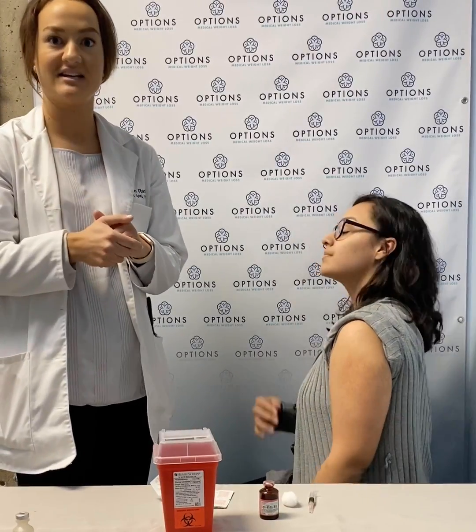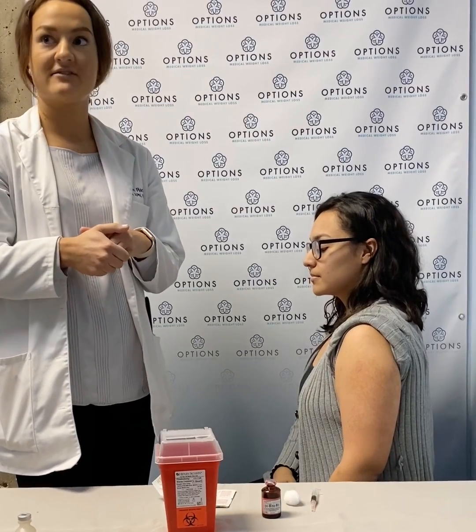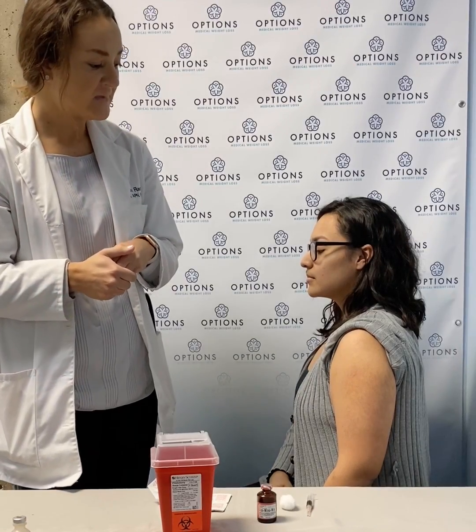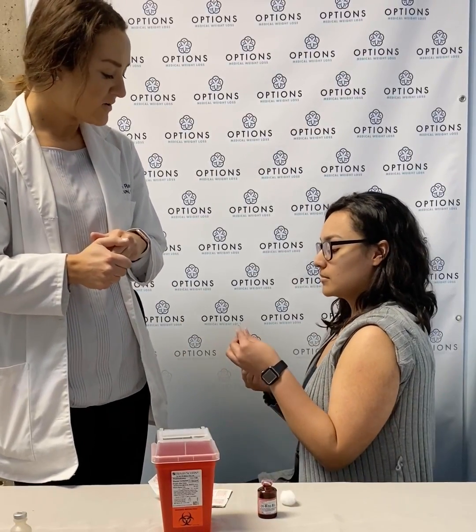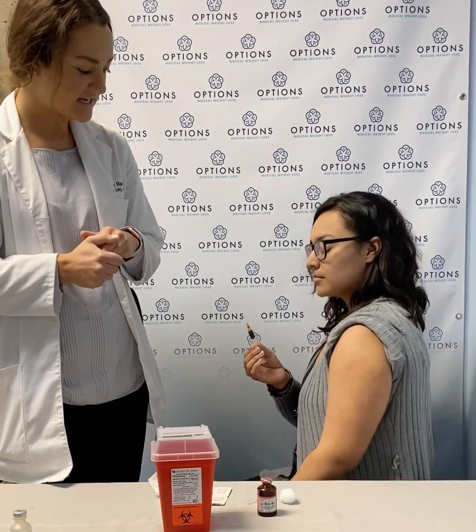You are going to clean more area than you need to, but that is perfectly fine. And we are going to let this area air dry for just a few moments here. We don't want the area to be wet when we do the injection. Now it looks like we are perfectly ready to go. You can grab your syringe here and take off the clear plastic top, just as Leslie did.